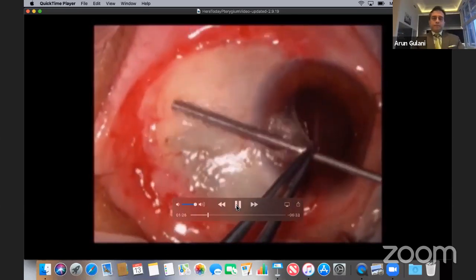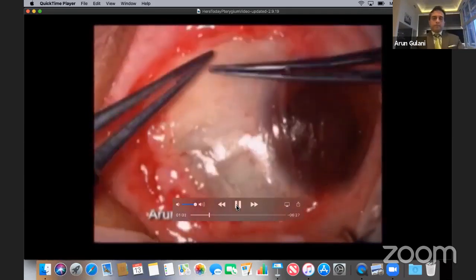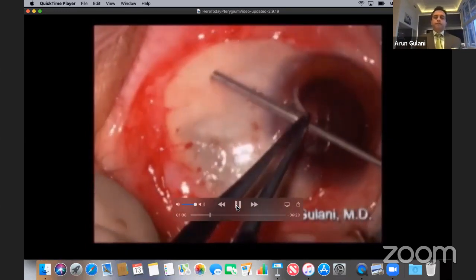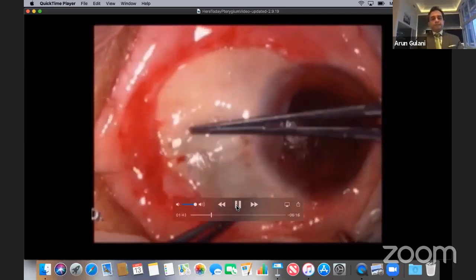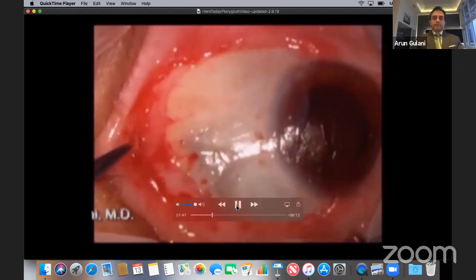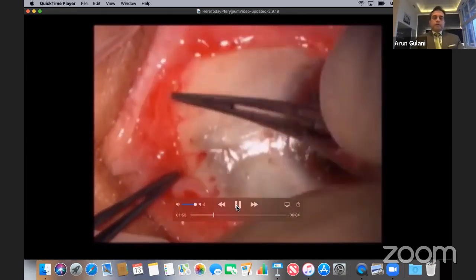First component of the tissue glue, delivered subamniotically in a controlled fashion. Sweep it into position, so you're also squeezing out excessive glue. Second component of the tissue glue, again subamniotic. Once again, sweep the amniotic graft and squeegee at the same time for good adherence. You can also place glue between the conjunctiva and the Tenon's, flattening this area as well as giving an excellent aesthetic appearance that will stay next day.